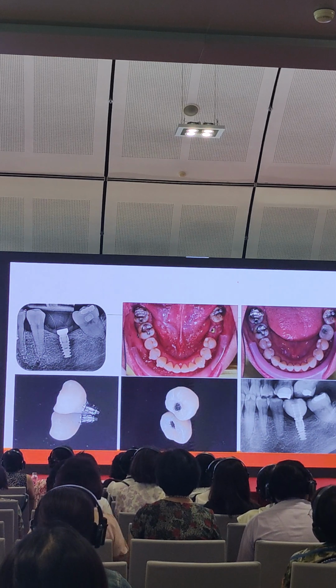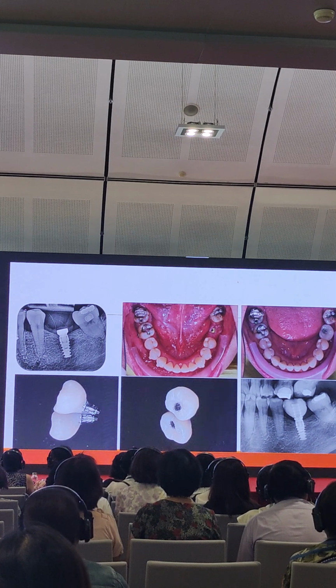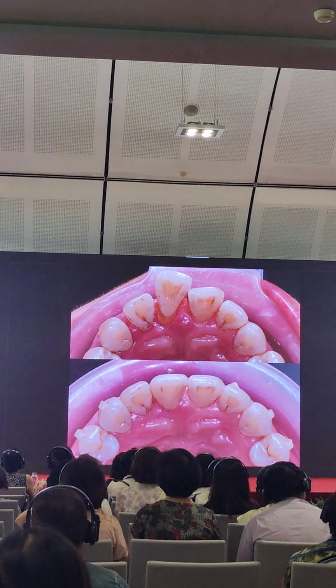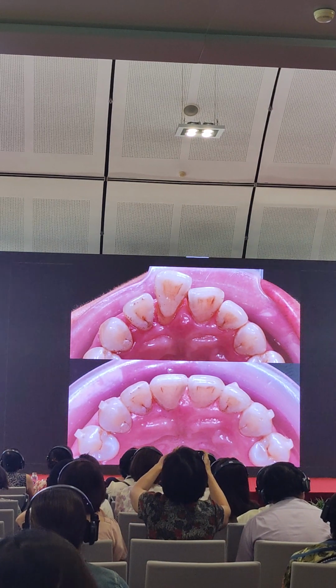And also it is an early improvement for the patient with one less missing tooth, and she can eat something with it. Okay, and we keep on looking at that perio situation.